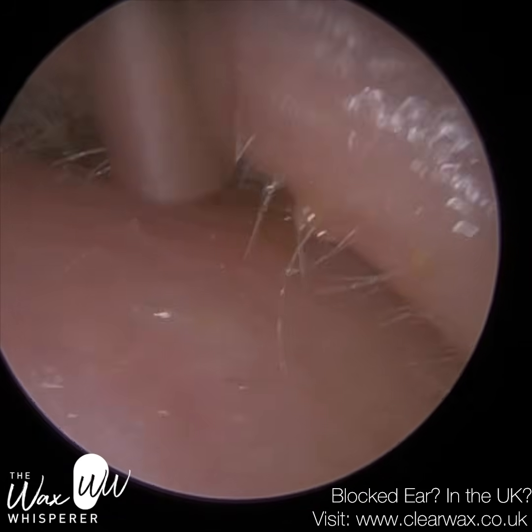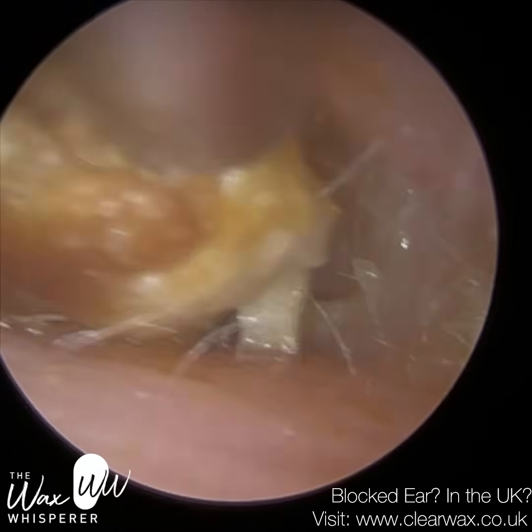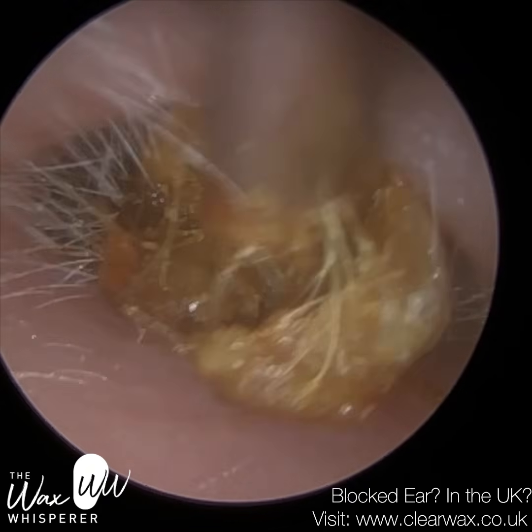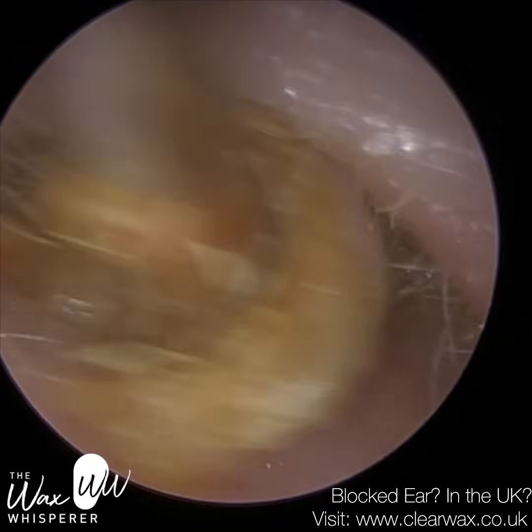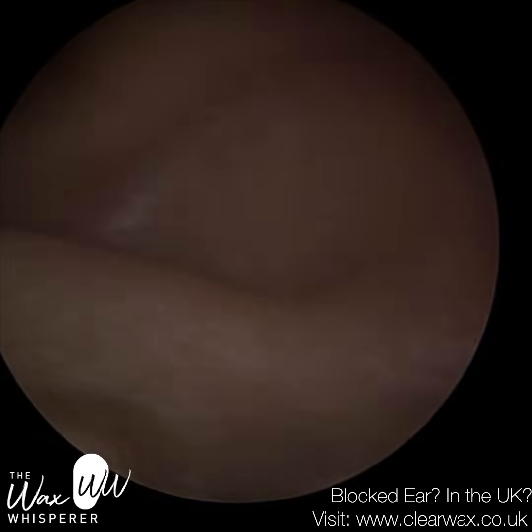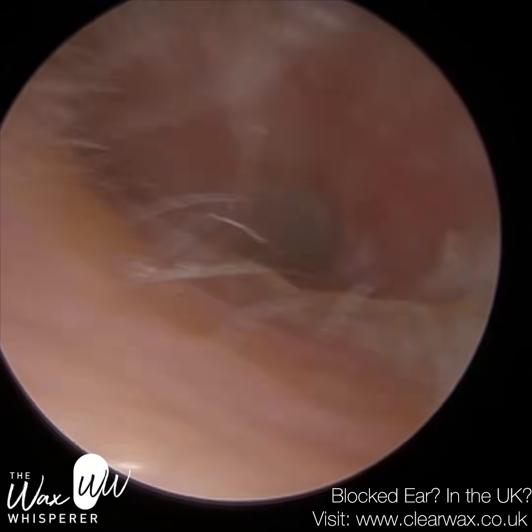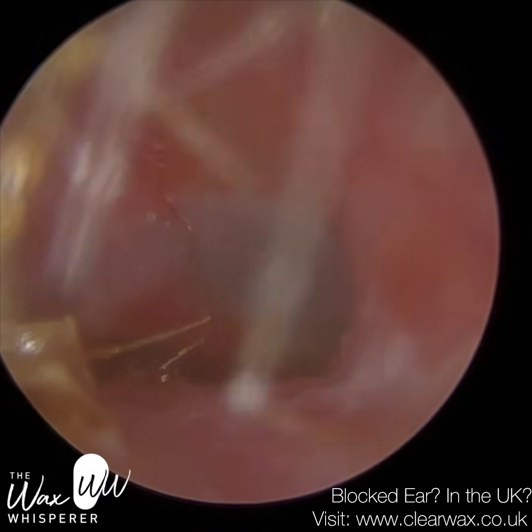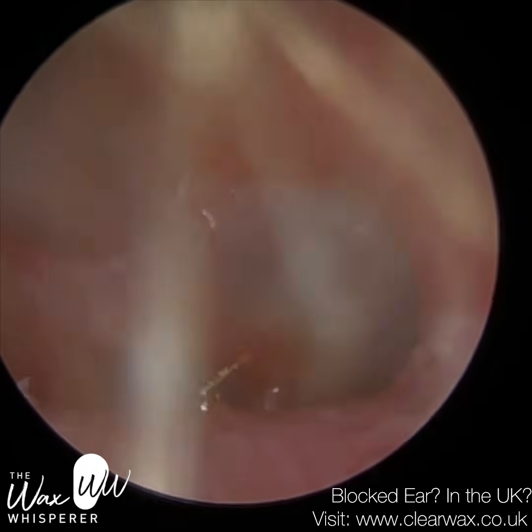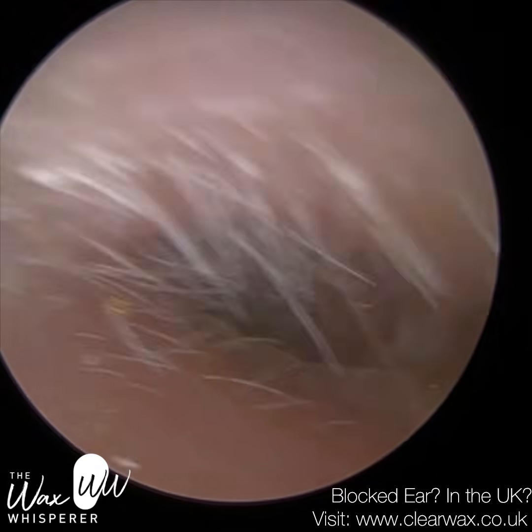You can have exostosis, also known as surfer's ear. That's when at the 12 o'clock of the ear canal, on the bony part of the ear canal, about 4 o'clock and 9 o'clock, you get bony spurs, so you can make contact with those. And they are somewhat similar to osteomas. Osteomas are more singular bony spurs, as opposed to surfer's ear, where you get this arrangement. You normally get 3 or 4 in that 12 o'clock, say 3 or 4 o'clock and 9 o'clock position. With an osteoma, you can find one in isolation. So you always have to be careful when you can't see the inner depths of the ear when you're using hooks and scoops and forceps, that you don't inadvertently come in contact with it.